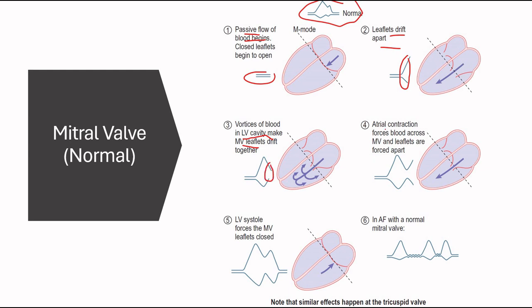So we see this divot down here, as the leaflets come back closer, and during atrial contraction, it forces the blood through the mitral valve and into the left ventricle, which causes the leaflet to open back up again, as you can see here. And during LV systole, it forces the mitral valve leaflets to close back up, and then you see this leaflets coming closer together, and then you see these leaflets are closed.